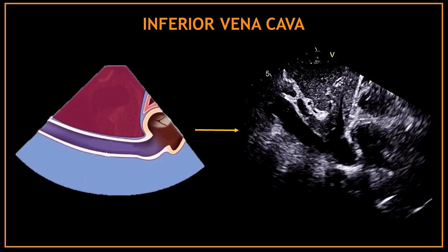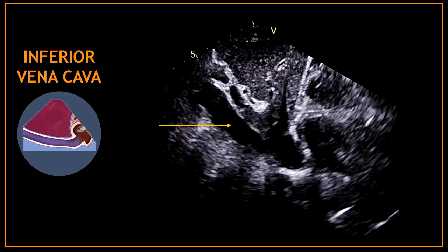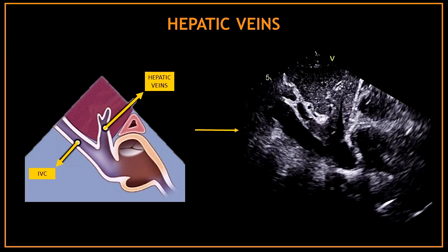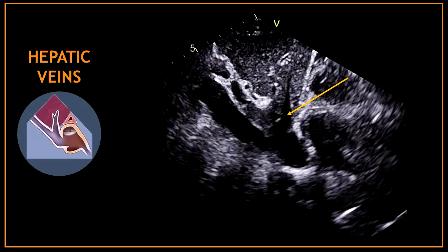One of the most important structures obtained from the subcostal view is the inferior vena cava. This black horizontal line is the inferior vena cava, and normally we assess here the inferior vena cava size and inspiratory collapse. Next to the inferior vena cava we can also find the hepatic veins — that black vertical line emerging from the inferior vena cava. This is also a very important structure to assess the right heart.